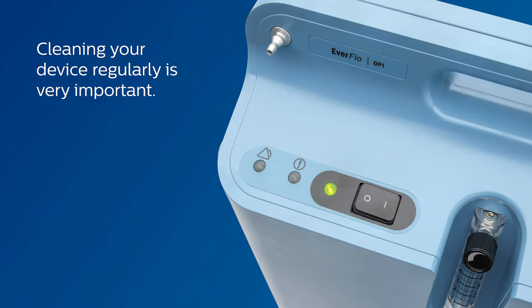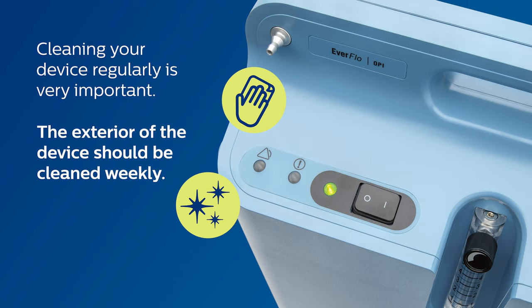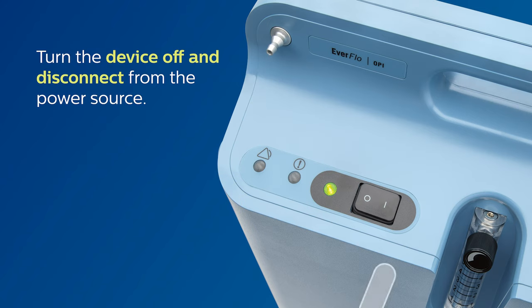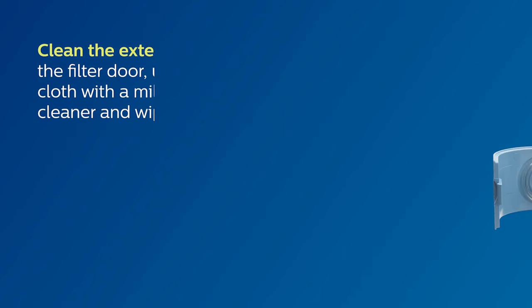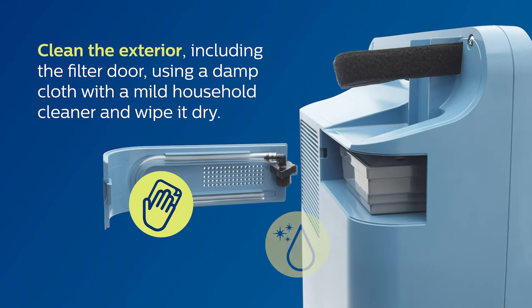Cleaning your device regularly is very important. The exterior of the device should be cleaned weekly. To clean, turn the device off and disconnect from the power source. Clean the exterior, including the filter door, using a damp cloth with a mild household cleaner and wipe it dry.